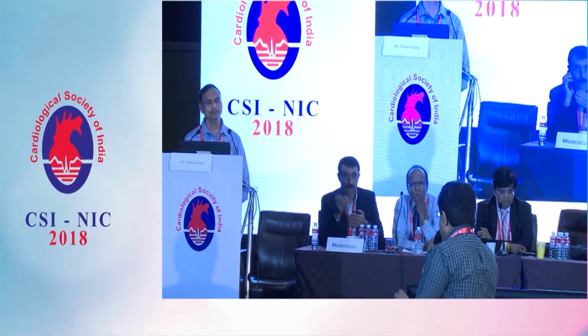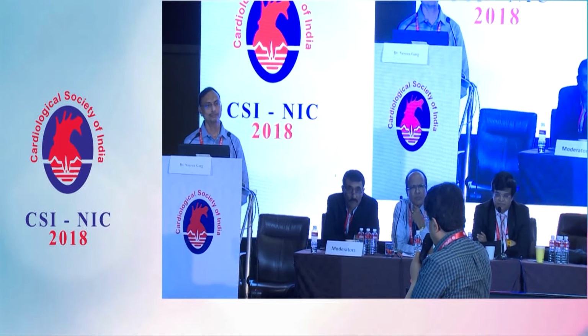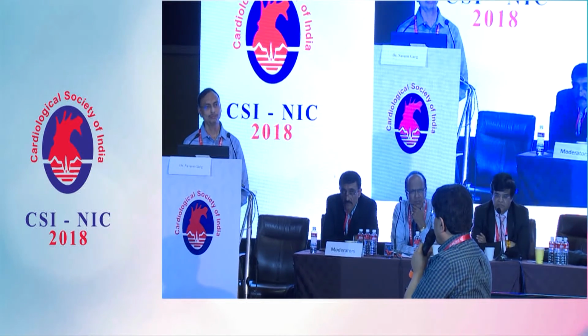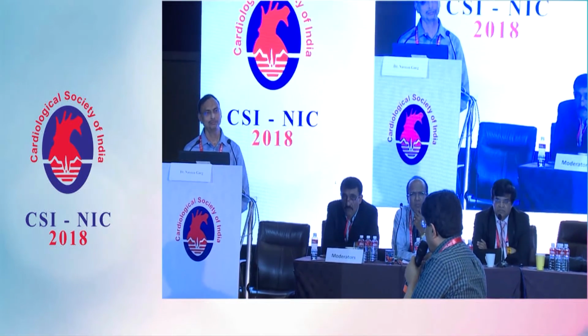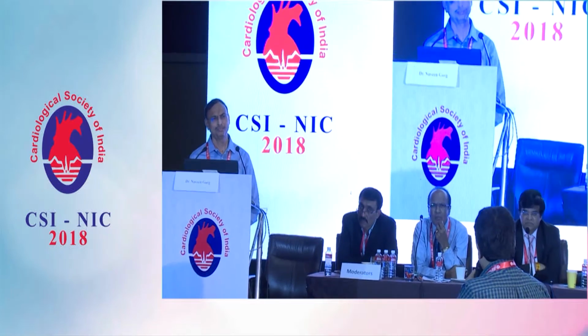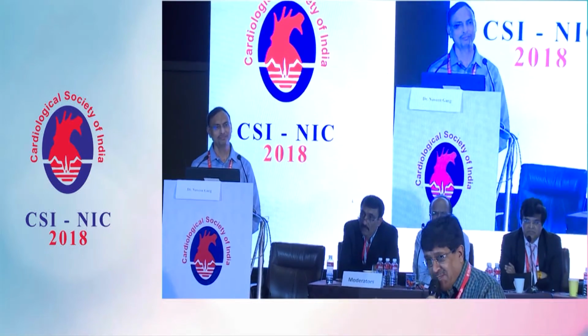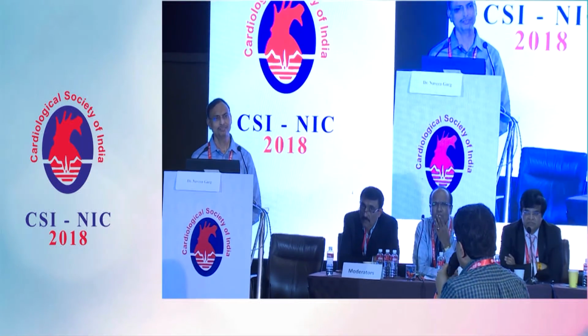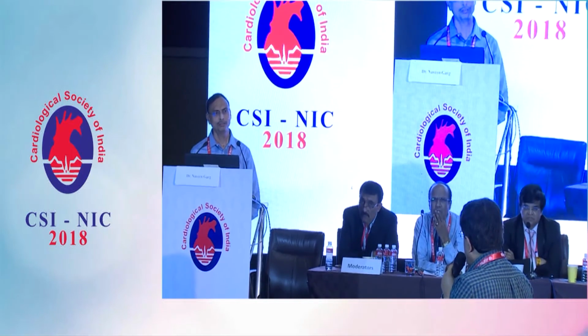Now for sheathless radial guide catheters, they also have a stylet. You do not need this pigtail business. This pigtail business, I told Dr. P.K. Goel some 7-8 years ago, and I think they have done a thesis on it also, which has come to me, that we have been using this pigtail in the catheter. It is okay as a poor man's process, because you still leave some space and you still disfigure the catheter. As far as the balloon assisted technique is concerned, it is very, very simple, very easy.